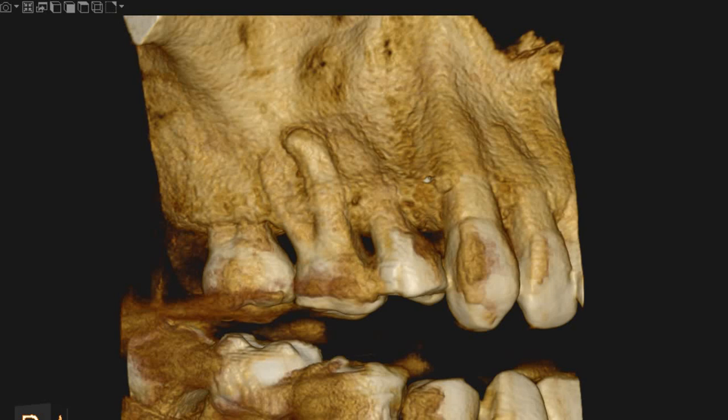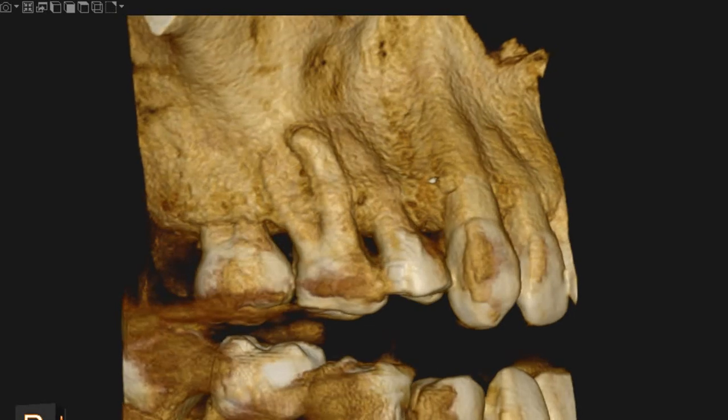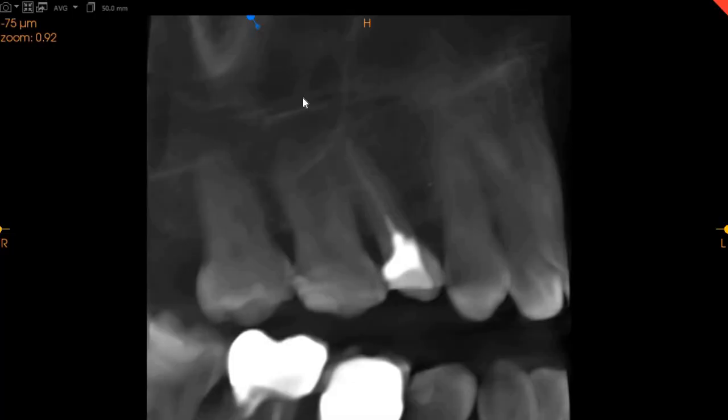Hello and assalamu alaikum. Ultra Scan Diagnostics here. This is the CBCT of the patient that you had requested. The area of interest is the upper right, and our doctors have asked for the missed canal.